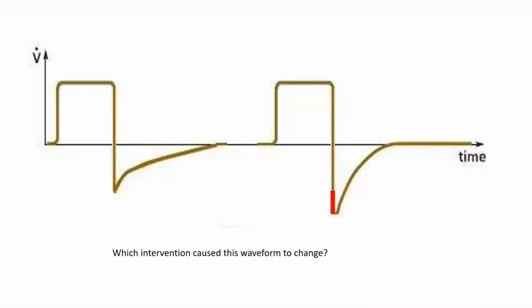Before I ask this, what scalar is this? There is a V on top. Volume. What scalar is this? Volume time scalar. Flow time. Very good. So the people who are saying flow are correct. So V with the dot is not volume. This is how it's represented on the ventilator. V with the dot really means flow. So don't get confused with the V over there.